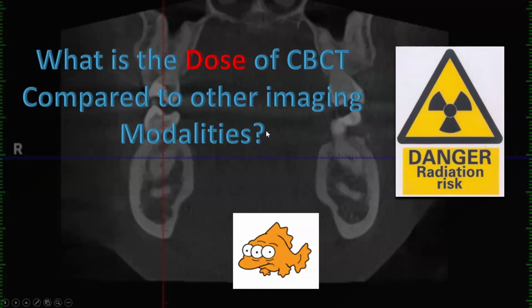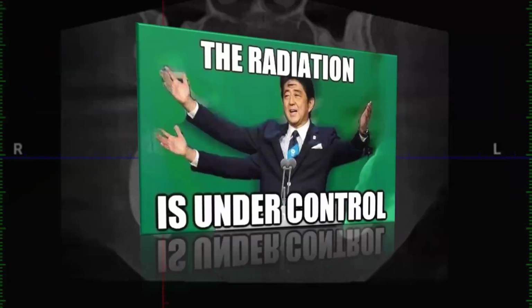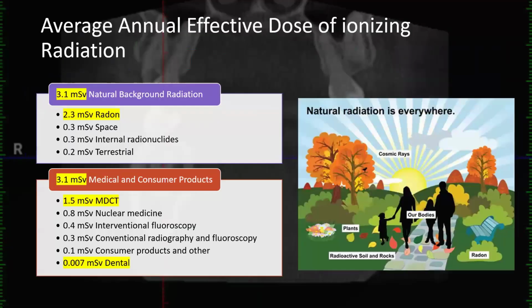With that low a dose, and you can see the bone where you need to, you're not going to see super high detail of structures. But for measuring bone for implants, you don't necessarily need sub-millimeter resolution. All right, so I sit here and I talk to you about how low the dose is. Of course, we always want to follow the ALARA principle, so we're limiting dose as much as possible.